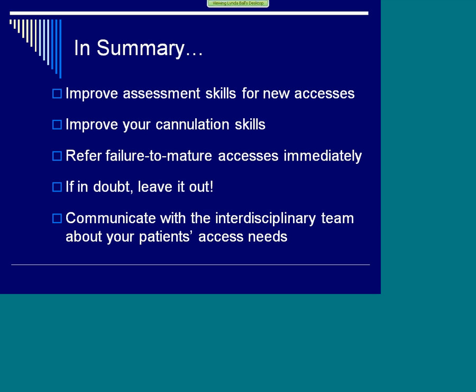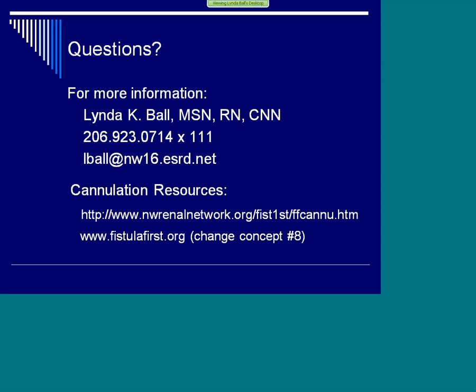Because some people do it differently. Some have the surgeons give them a release for cannulation. Some the nephrologists say it's okay to start cannulating. And some the staff are allowed to say we think it's time and tell the doctor and the surgeon that they're going to do that. And remember, if in doubt, leave it out. Because research has also shown us that if we continue to cannulate and infiltrate, we can kill that access.